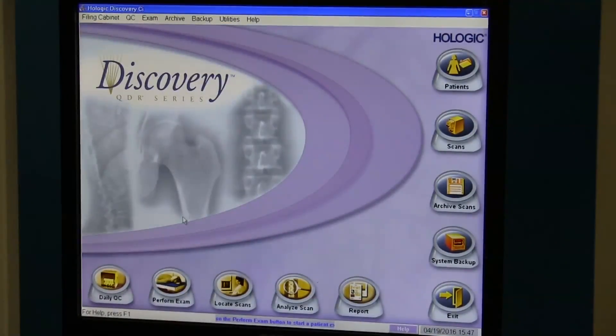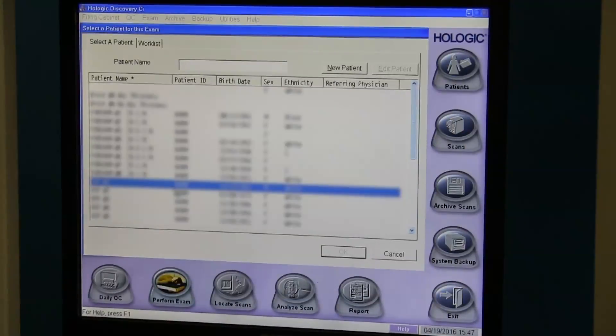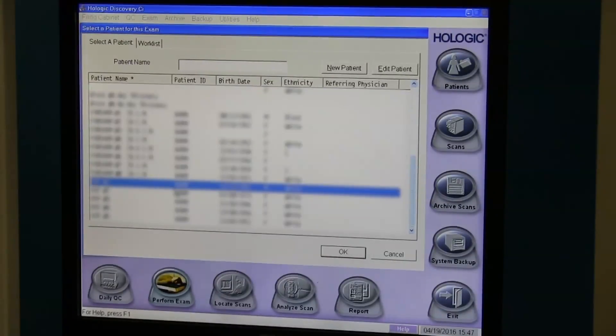Along with that, in order for me to perform an exam, I'm just going to select a test patient — say the Spine Phantom.